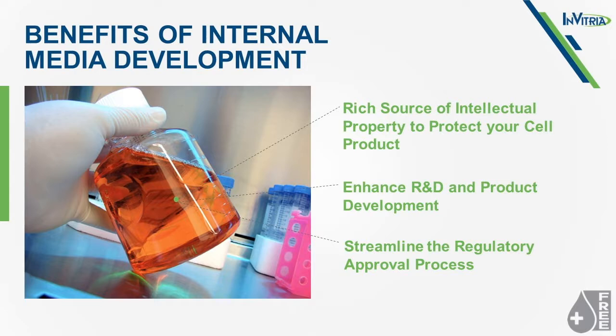However, in this type of approach, you're really relying on additional components that FBS is providing in order to support your cell culture system, and you're only adding back a few components within the media. So it's a pretty simplistic approach, but very, very quick and easy to do.